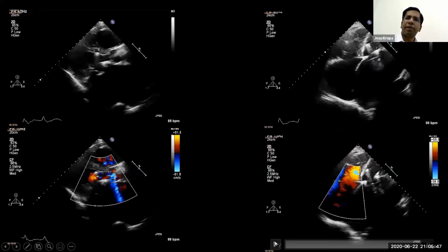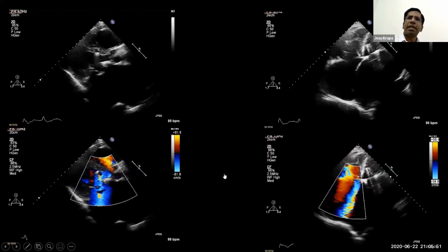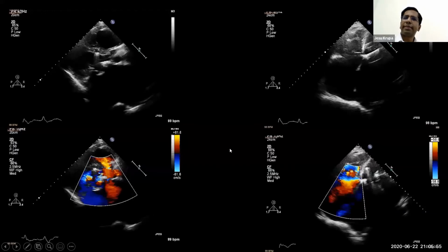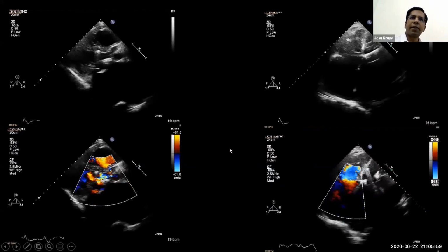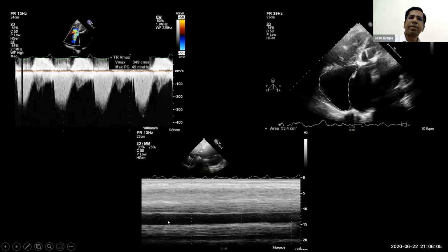But the main problem is that he has significant tricuspid regurgitation. Though an annuloplasty was done previously, the leaflets look fairly thin and not diseased, meaning it's unlikely to be organic. Yet he has severe TR, and most likely he's got a plethoric IVC, dilated right atrium, and most likely that is the reason why he is symptomatic.